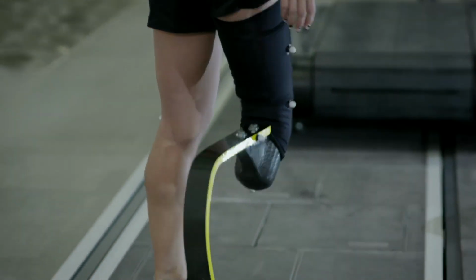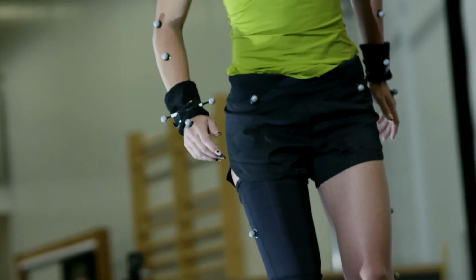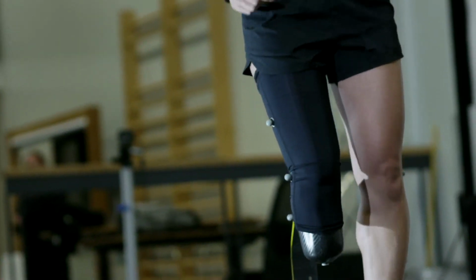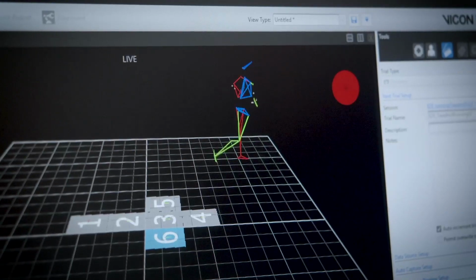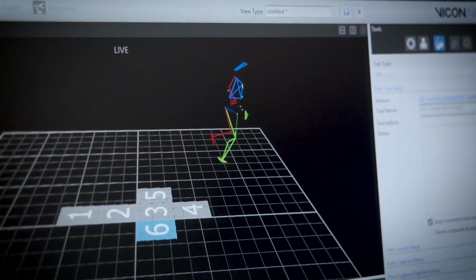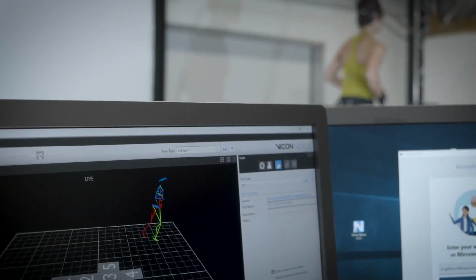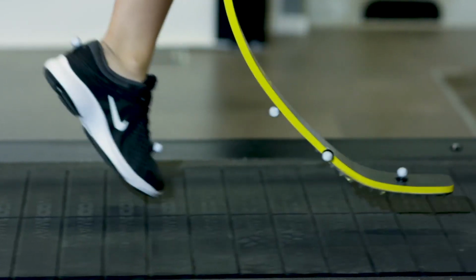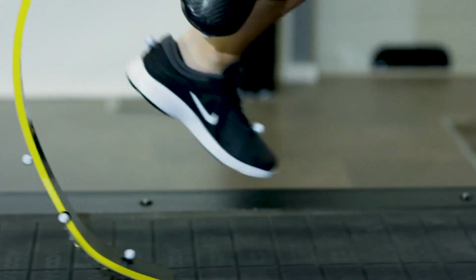Each blade is customised to every athlete, taking into consideration their physical attributes, running style and the forces they're applying, as well as the sport that they participate in. We're dealing on the biomechanical side with the most advanced gait labs that are available. So we're talking about Vicon systems, force plates, that are basically telling us, objectifying what it is that the athletes are trying to tell us as well. They're telling us what it is that the foot is or isn't doing to make sure that we understand where we can potentially tweak. The design process draws parallels with that of motorsport, where changes are being considered that can shave fractions of a second or add small distances to performances.